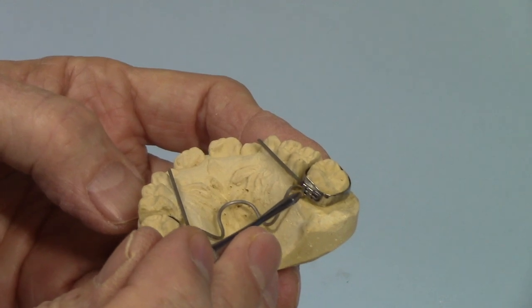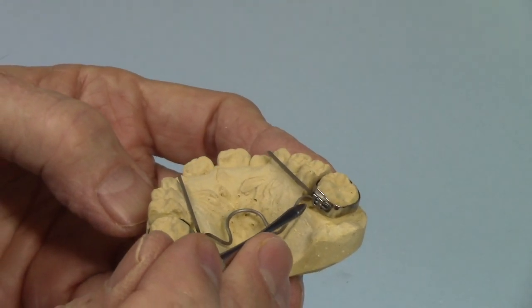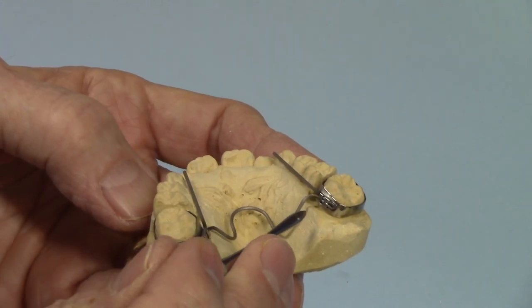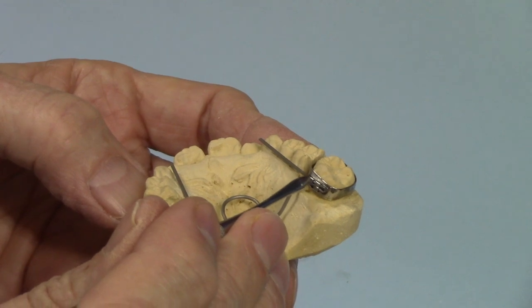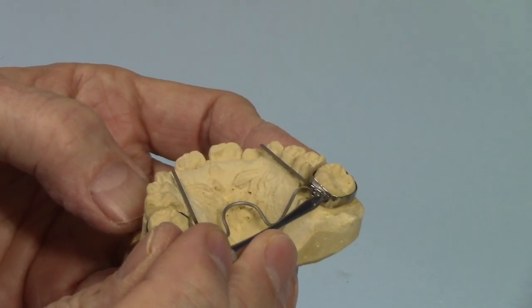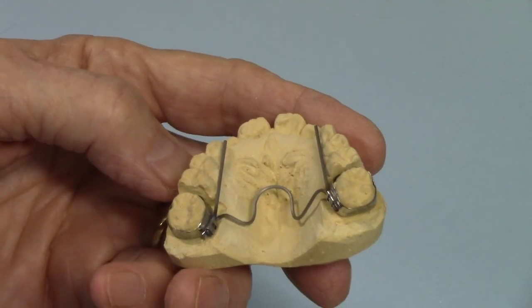This particular doctor wants the wire to be attached firmly to the band. So I'm going to solder it as-is to the band, and the solder will go inside the lingual sheath and lock this titanium wire in, so it will become a fixed appliance.